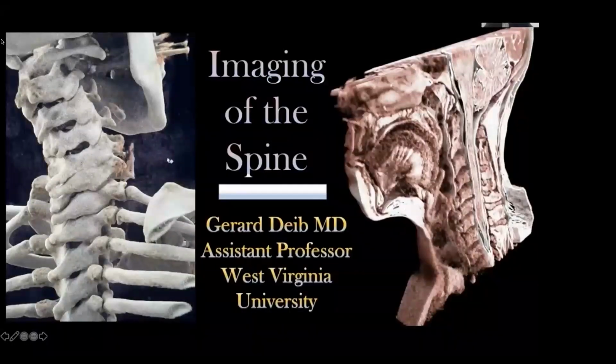I'm a neuroradiologist as opposed to a surgeon. I do diagnostic and interventional work. Today, we're going to be focusing on the diagnostic portion of that work. Obviously, imaging of the spine is an enormous topic, and I'm just really going to show you some highlights. I'm also going to point out a few anatomy tips and tricks, really.